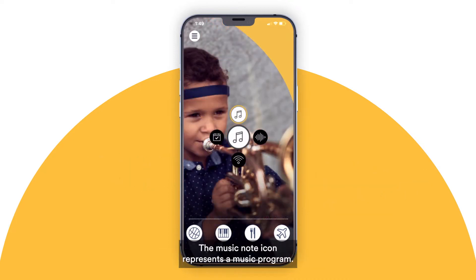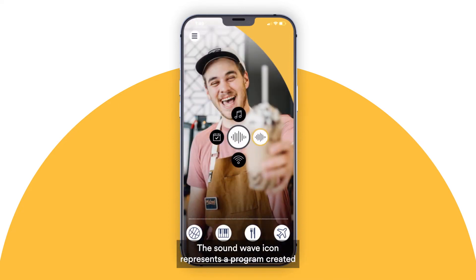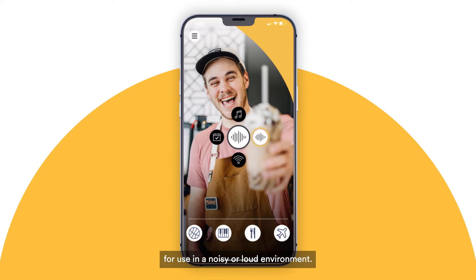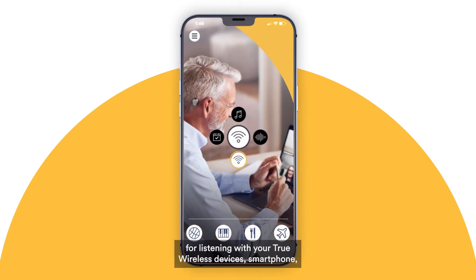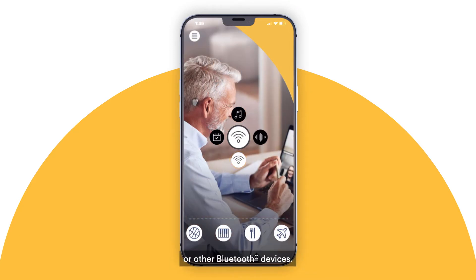The Music Note icon represents a music program. The Soundwave icon represents a program created for use in a noisy or loud environment. The Streaming icon represents a program for listening with your true wireless devices, smartphone, or other Bluetooth devices.